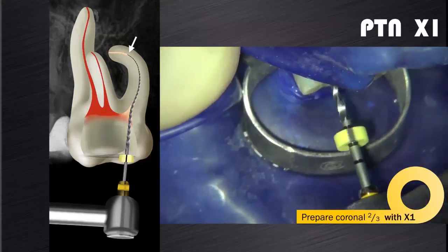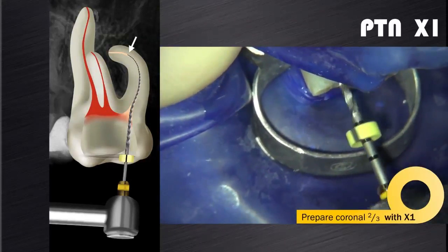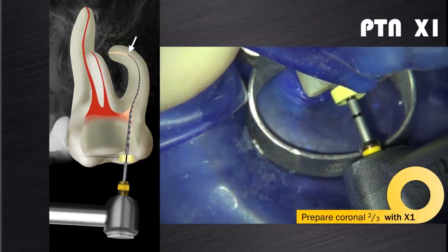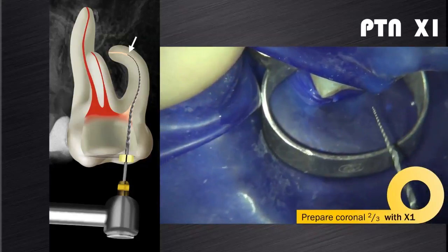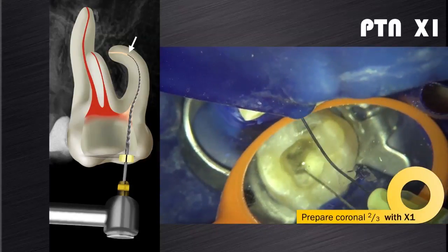In this video, you can see that I introduced the X1, brush my way down for a few millimeters, but then experience complete resistance, and I could feel that the instrument takes a lot of strain. In these situations, it is recommended to back out of the canal and follow with an irrigation cycle to remove debris and to check patency.